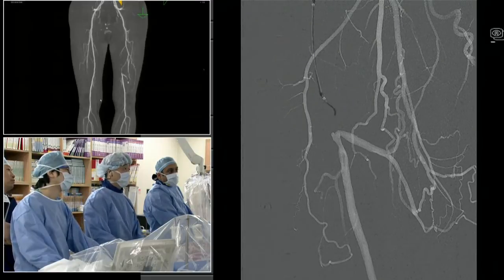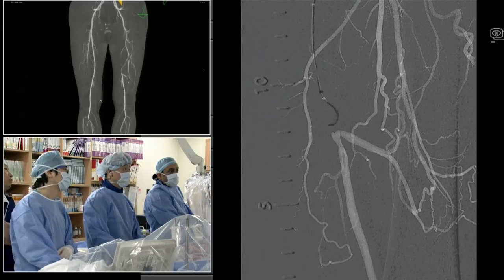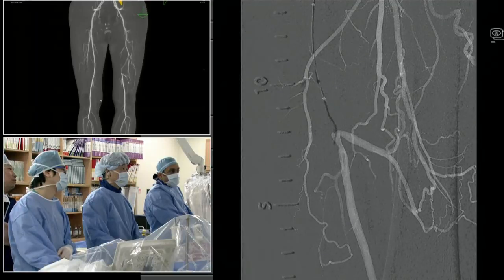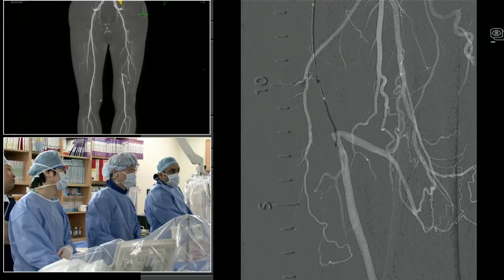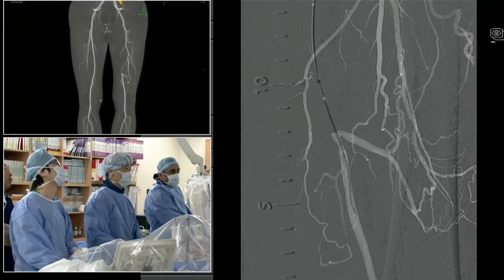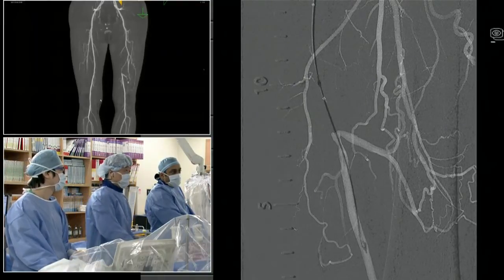It's interesting, a case like this with the reentry devices, as well as the fact that this is a fairly straightforward case to go popliteal or pedal. I usually don't go pedal unless there's critical limb ischemia, but to some extent you can be relatively aggressive knowing you can do that. That's looking good. If it was a total flush occlusion at the SFA, CFA, yeah. There we go. That's looking excellent. Very good. Excellent. Good job.